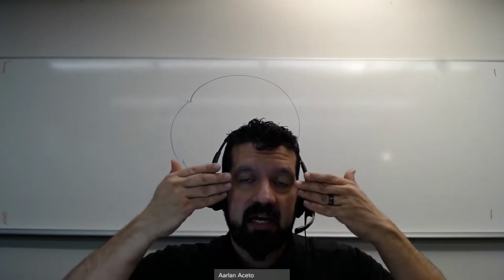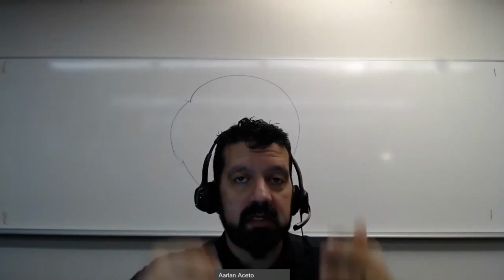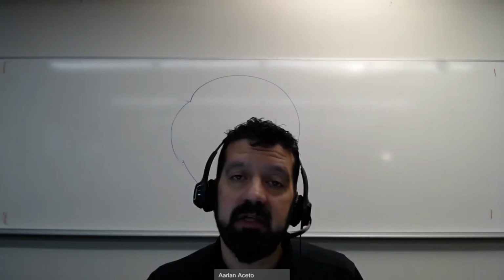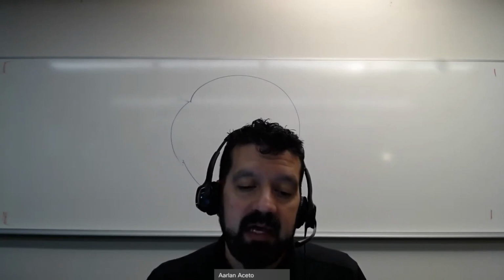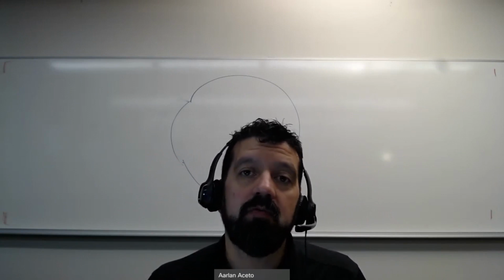With contact lenses, it's obvious that your contact lens is not at the same distance away from the patient as the phoropter was, because the contact lens is in touch. It's on the surface of the eye, so the vertex distance, the distance from the lens to the patient's eye, is significantly different, especially with contacts. We're going to go over residual astigmatism again, and then finally we're going to get into the real meat of this unit, and that is the toric lenses.